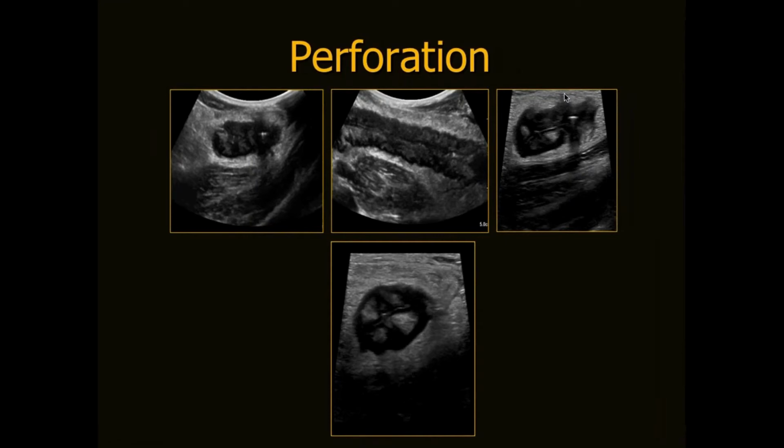I hope that I've shared with you, even in the stuff I have shown you, that ultrasound, I believe, does show the stenotic and penetrating complications of Crohn's with great accuracy. And so for the patient that comes at diagnosis, for the patient undergoing surveillance, and for the patient with acute presentation, I think ultrasound plays an excellent role.